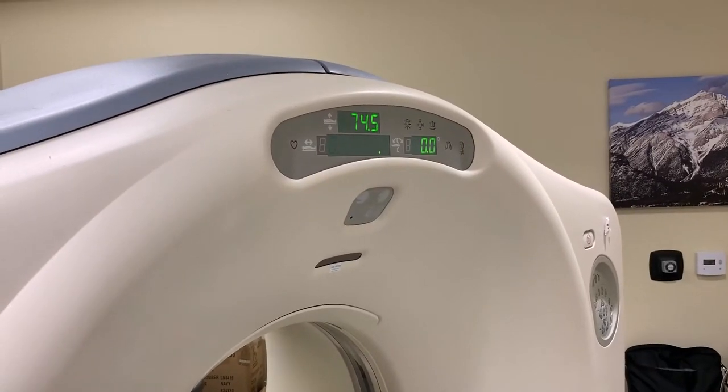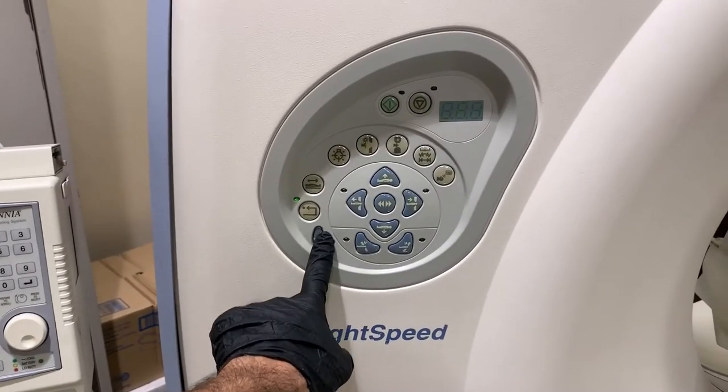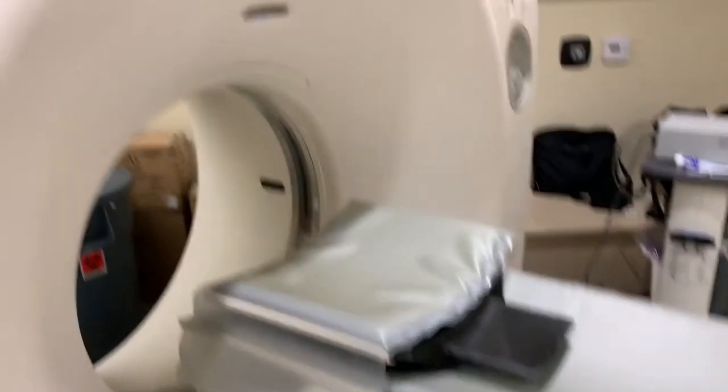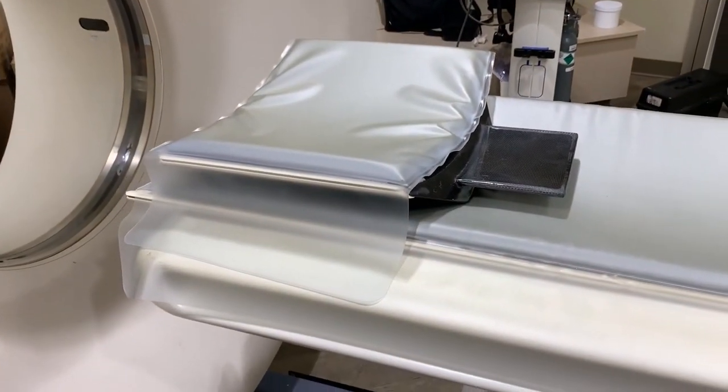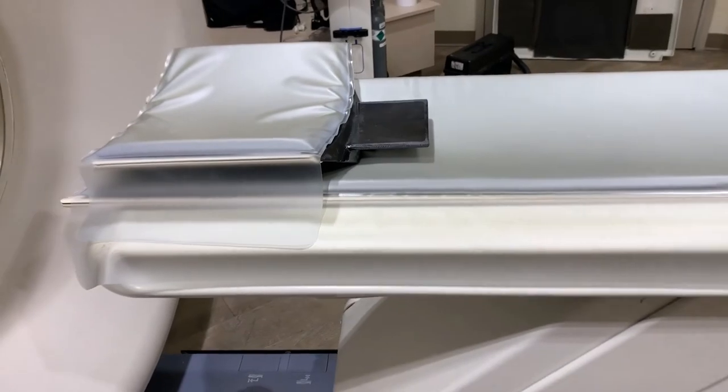Press the home button on the gantry interface panel to return your table to its original position. Your CT scanner is now ready to scan.